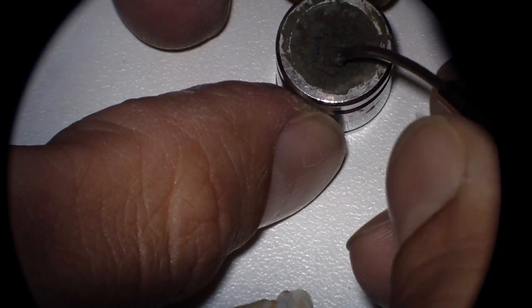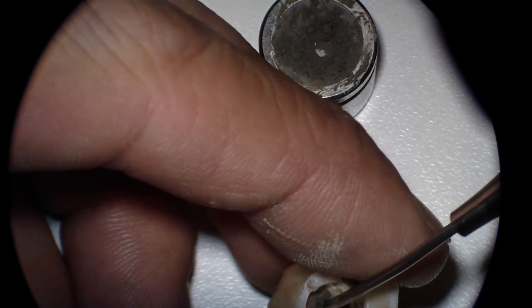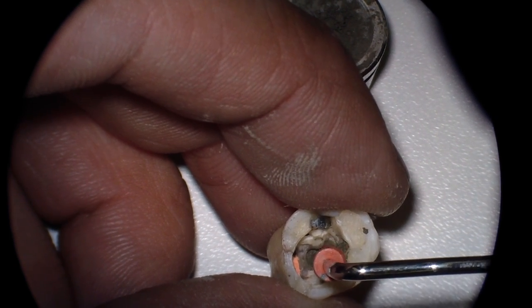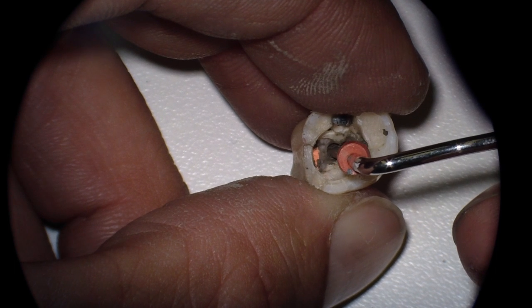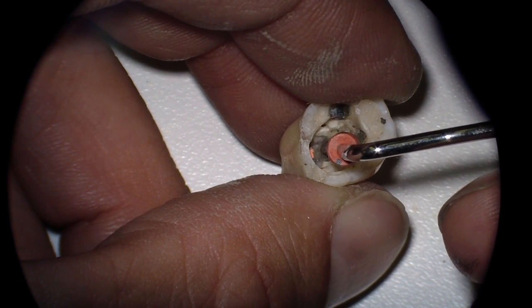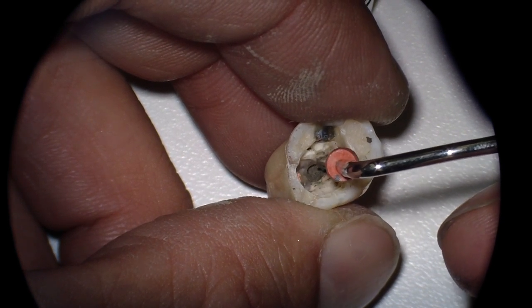And there's another good demonstration of not pulling back on the piston of the MAP carrier. Now, what you can do afterwards is take your ultrasonic instrumentation and lightly tap on the condenser in an effort to make sure that the MTA is intimately condensed against the walls. I'd fill this a few more times in an effort to get this flush with the pulpal floor.